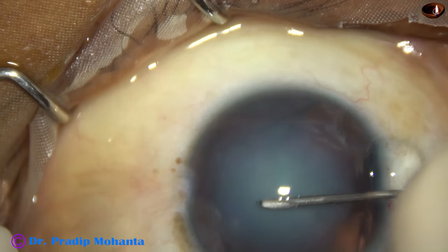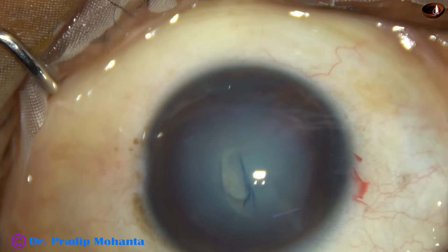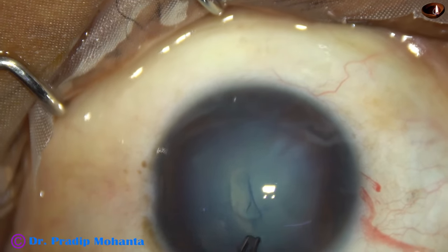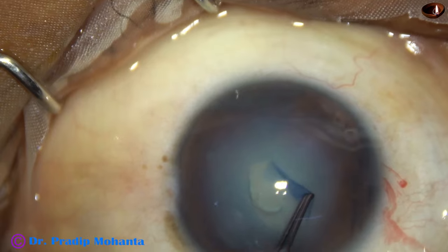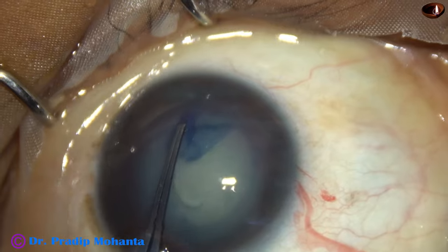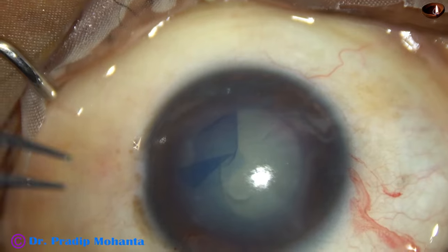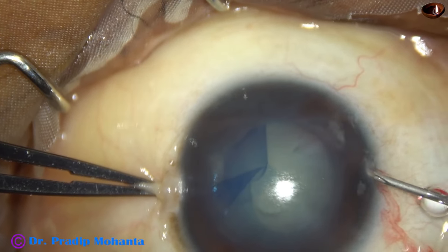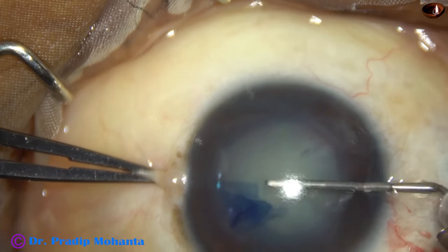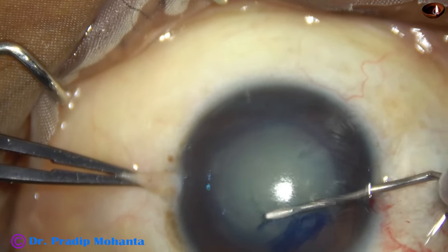The anterior capsule is being incised by a cystitome — a 26-gauge bent needle. Now I am using my left hand to do part of the rhexis from 11:30 o'clock to about 5 o'clock. Now I am using the cystitome to complete the rhexis. This is the area where the zonule is firmly intact.